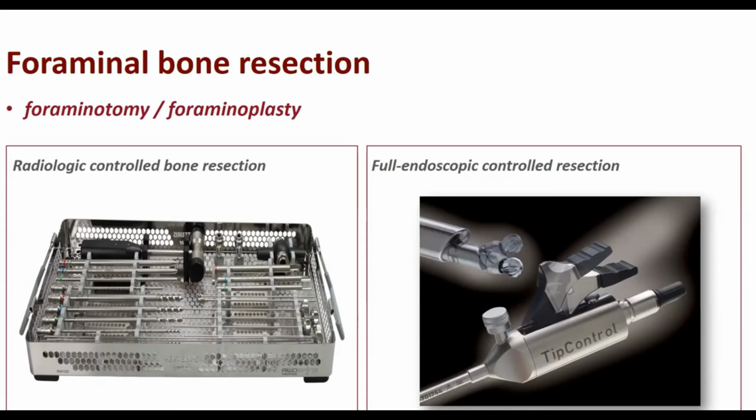It means that the operation is divided into two parts. The first part is manual drilling under the fluoroscopy. It is kind of a blind approach. And in the second part, you do the operation with your endoscope.